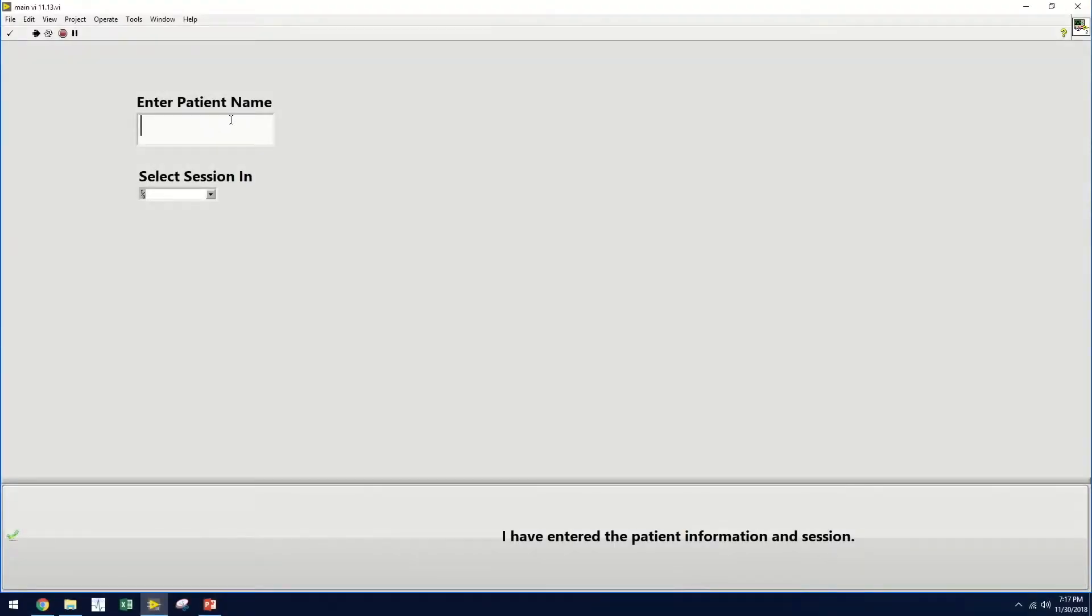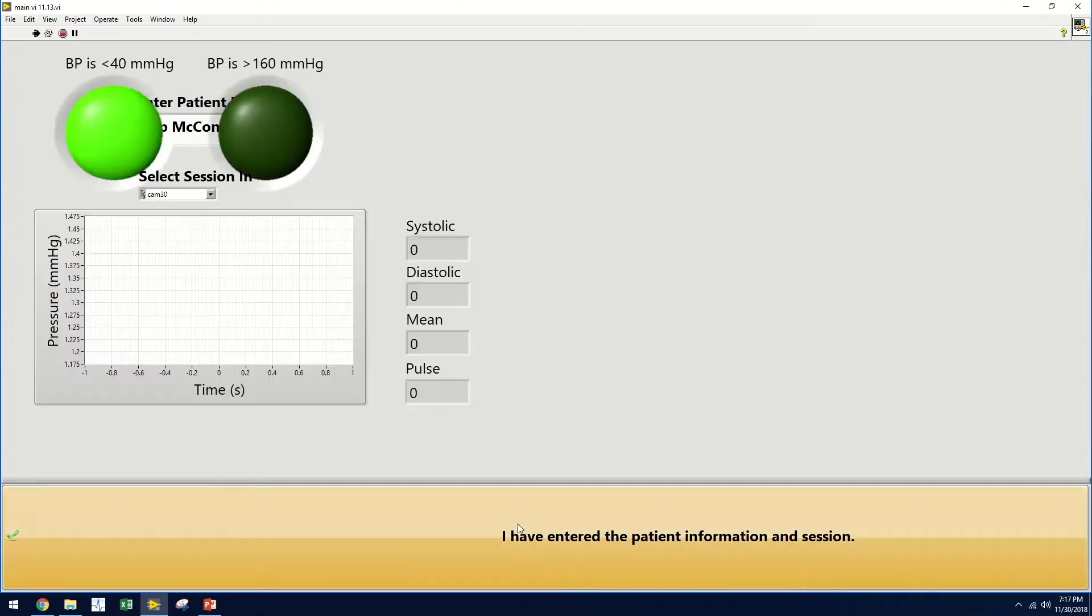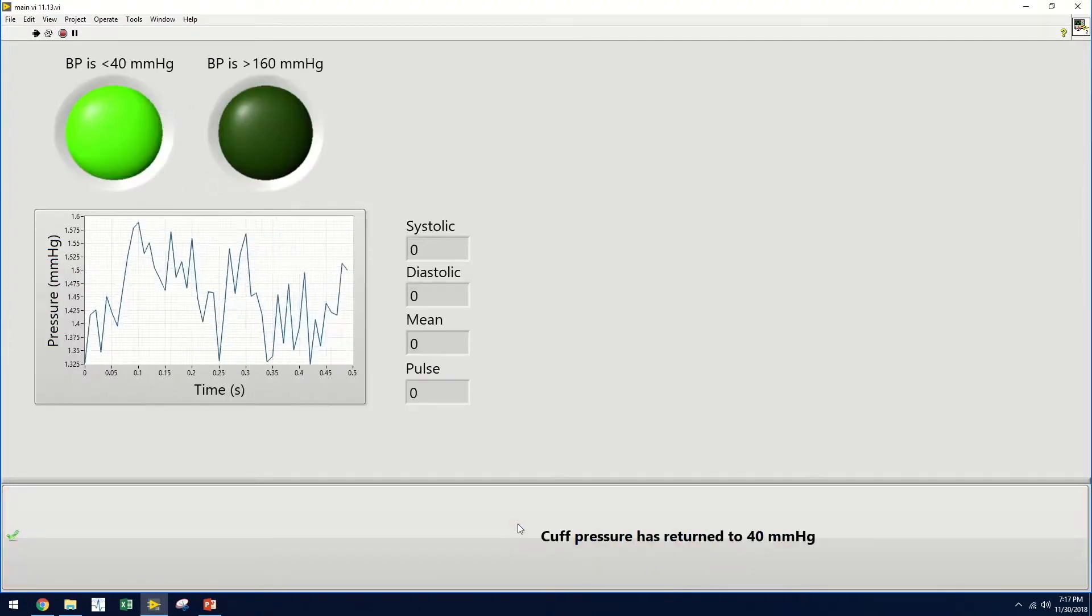So let's show you how this works. The user, a medical professional in training, will first be prompted to enter the patient name. This will be used to create or locate the patient profile, which will save relevant information like vitals and the successful vein image. They will then select the camera session and indicate that they have entered all of this information.